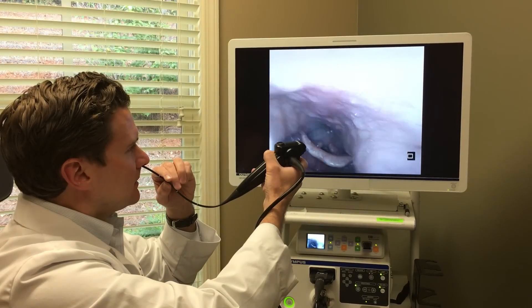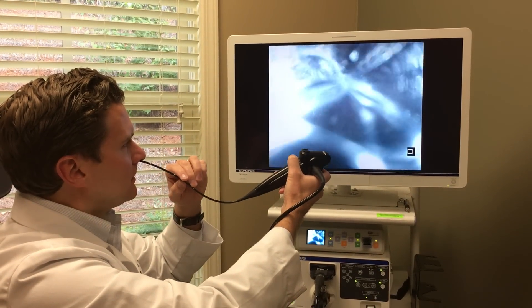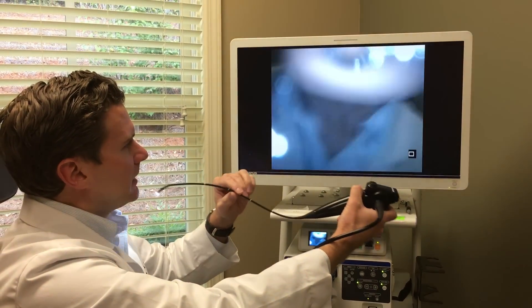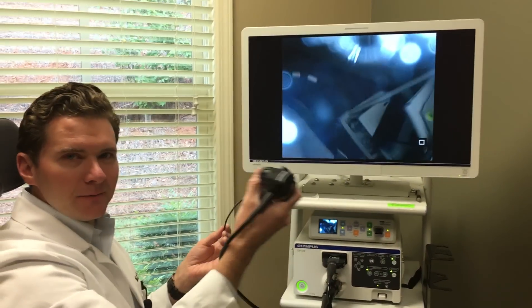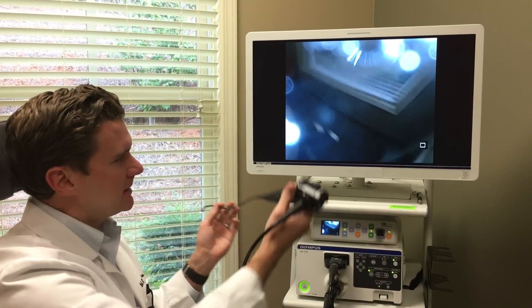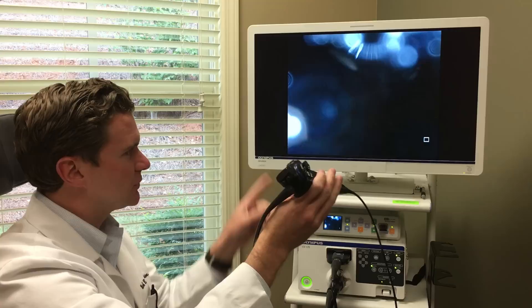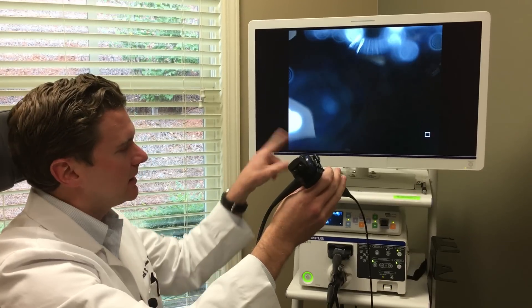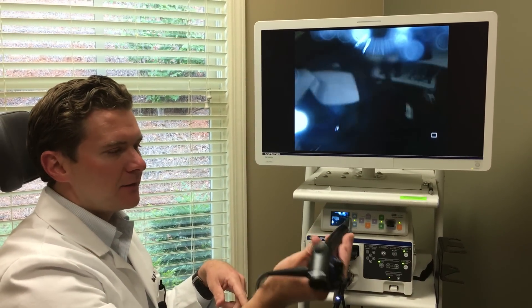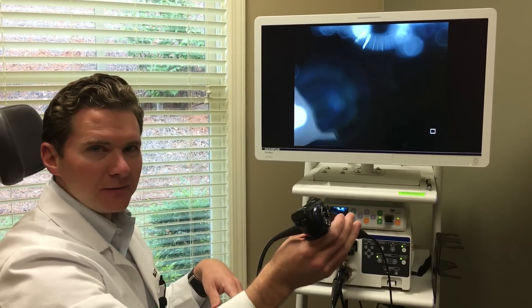Everything there looks good. I'm going to come back out. And that's it — so not too bad. If you ever need this done, it's nice to be able to see it on the screen. We record it here and show patients what we're looking at when we look down there. So nothing to be afraid of, but definitely a little bit of a different sensation.